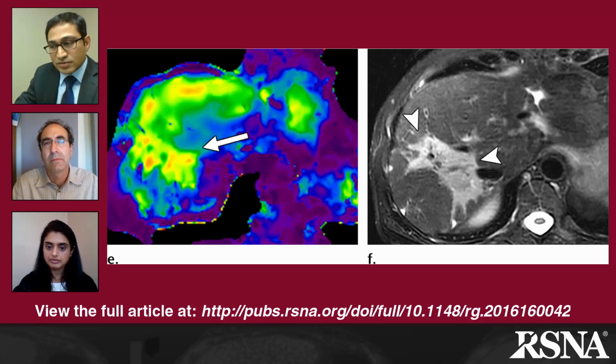So this kind of information is useful, let's say, in a patient who comes in with early autoimmune hepatitis or primary sclerosing cholangitis. If you do an elastography and you see some areas of stiffness and some areas of normal stiffness, and you want to do a biopsy for any clinical indication, such as for going into a trial, you can actually direct where to do the biopsy in order to get a positive result. So MR stiffness maps can be useful for that, to do a biopsy if at all needed.